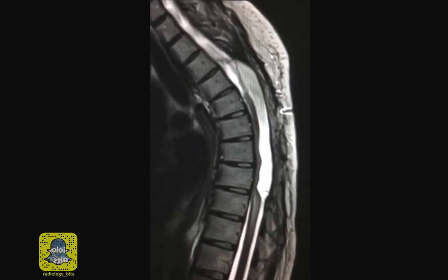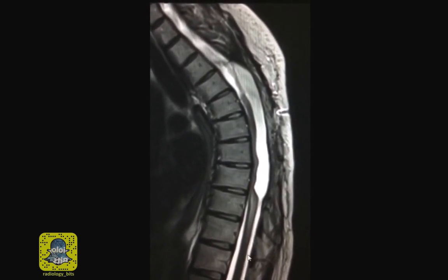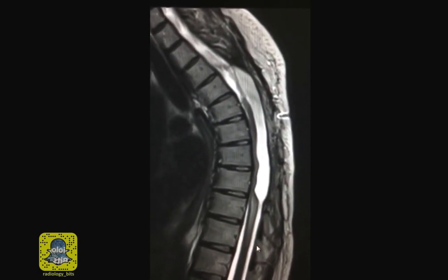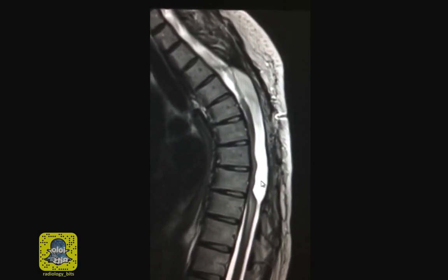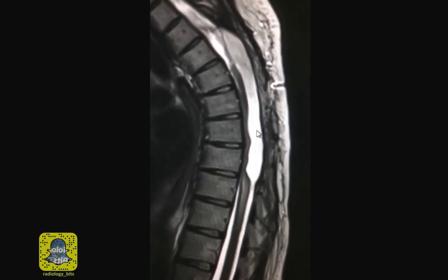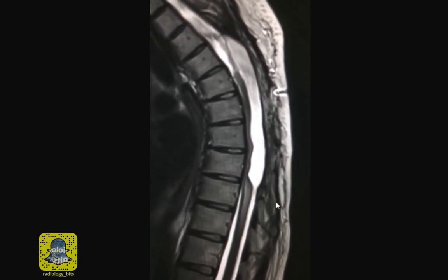Finally, a more invasive way is to inject contrast into the space here, a myelogram. With that, the myelographic material would fill the space easily if this is anterior cord herniation, versus delayed filling of the space if this were to be an arachnoid cyst. MRI or CT or fluoroscopic myelography could be used.